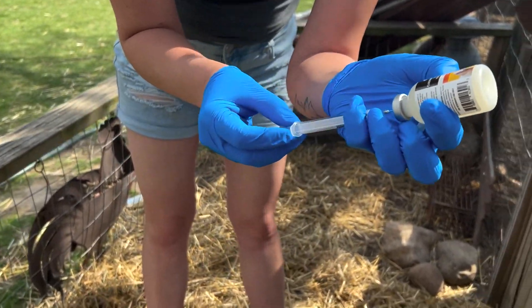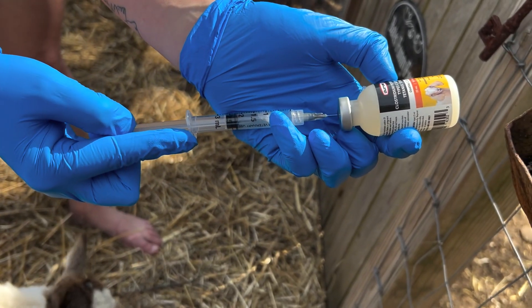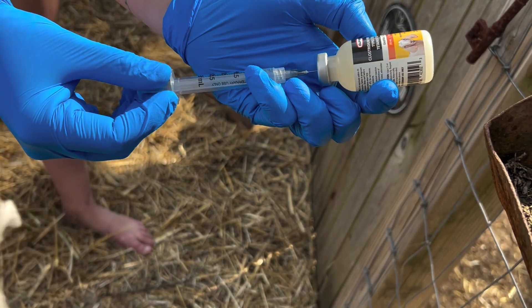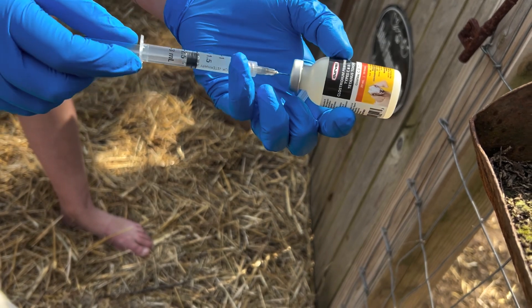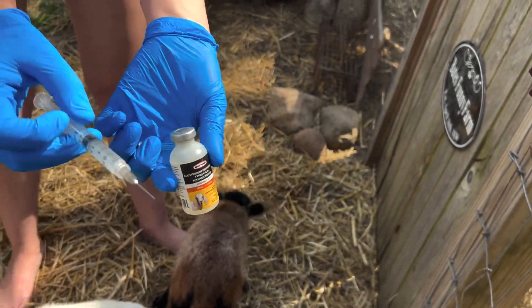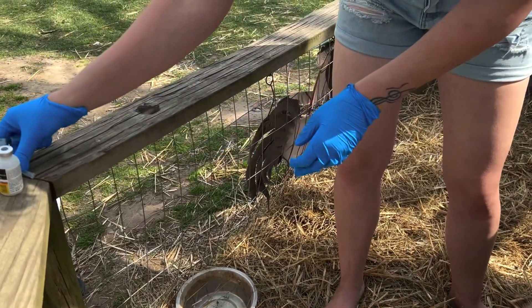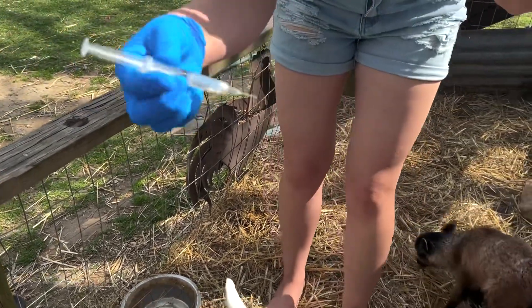You just do a two-milliliter dose. I'm using a syringe that holds three milliliters, which is good because you always want to draw a little past it since it's going to pull back on you, and you want to make sure you get a full two-milliliter dose. Pull it out so it doesn't suck any back in. You do this dose at six to eight weeks, and then three weeks later you're going to do another dose.